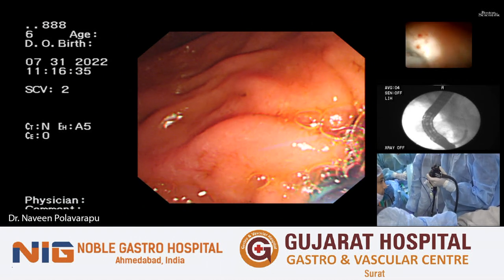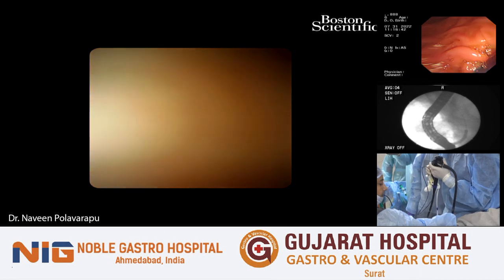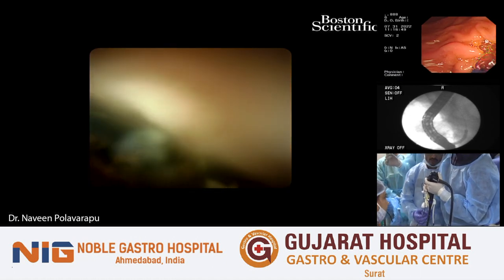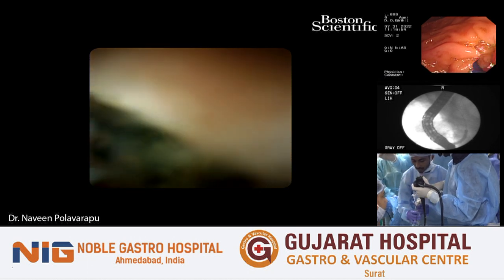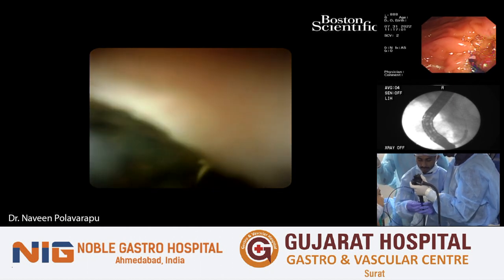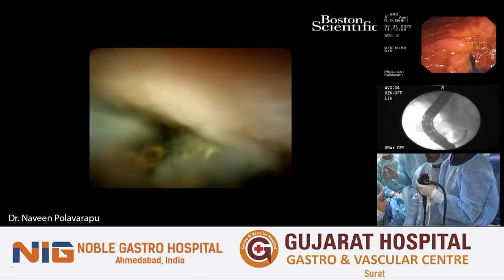Now, is that the stone or is it a polyp? It could be just a mucosa as well. Can you put more water? Yeah, I'm just flushing it constantly. Thank you. So I'm just putting more flush. I think that's where you can see the stone there.